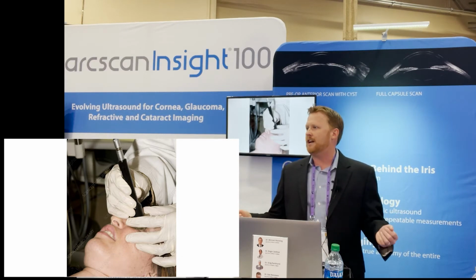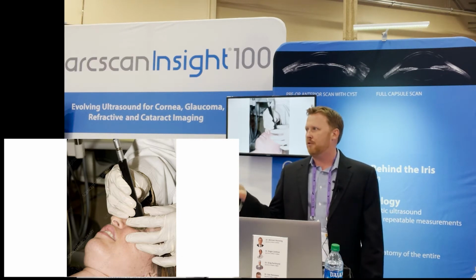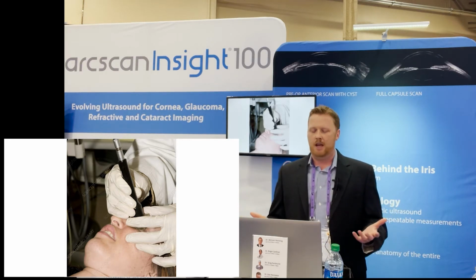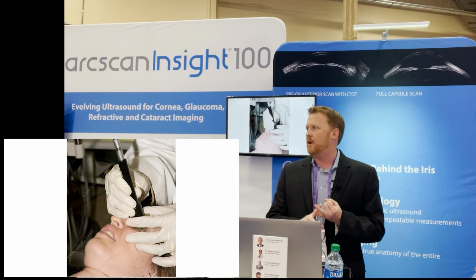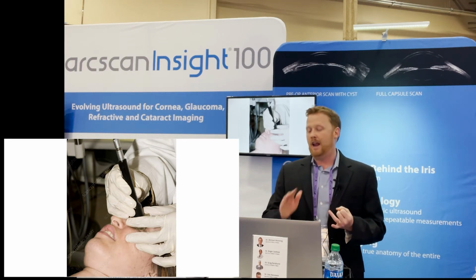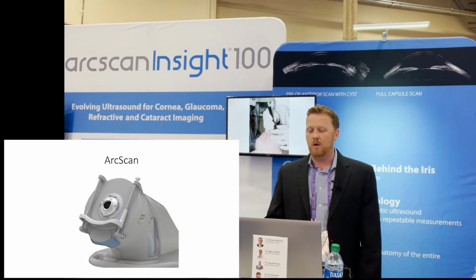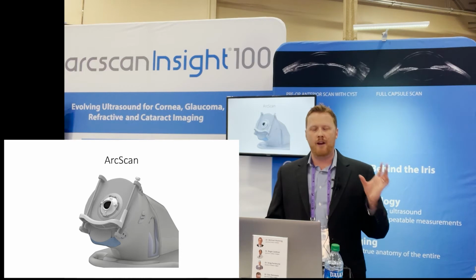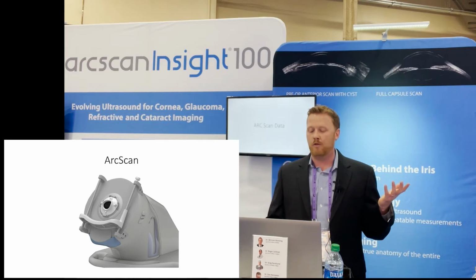And when we're talking about refractive surgery, not only do we want to deliver a premium result for the patient, but we also want them to have an amazing experience. The two challenging parts with ICLs are not the actual surgical procedure, it's the UBM and the PI that we have to do. Hopefully the PI is going to be going away soon once EVO's coming out. And now with the ArcScan, as I'll show, we have a very good, reliable machine that can take very nice measurements for patients, and the patients are not traumatized at all by this thing. I mean, it's very comfortable for them.